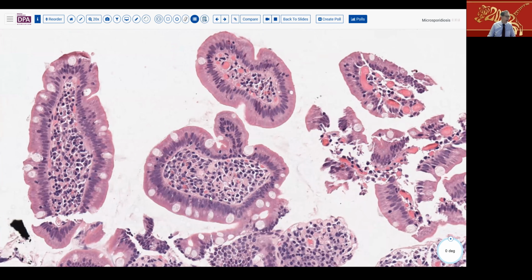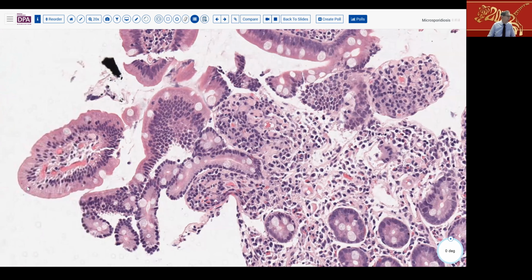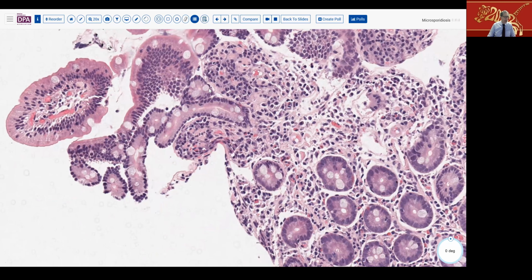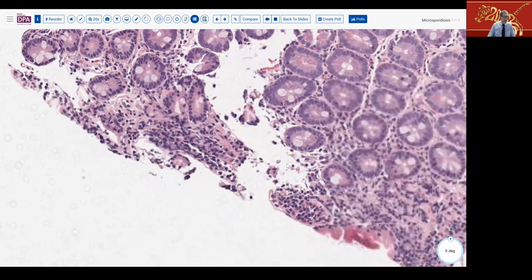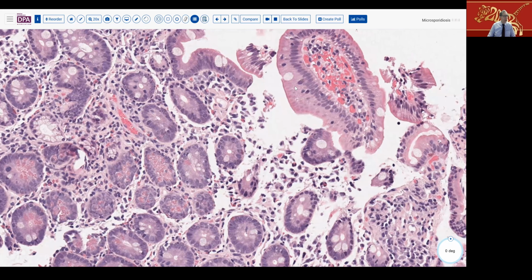Here's a few here. I know I looked hard on this and had a difficult time sometimes finding them. Here's a couple over here, and some of these cells. So you can see here in this particular sample, it's much more subtle. And you can come back and look at this. So we'll provide the link to these in the comments. Here are maybe some more out in here.